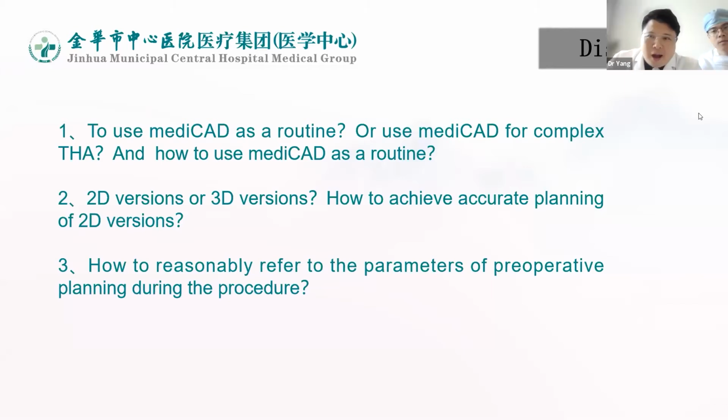So I can't agree more. In China, we must now do the templating with mediCAD, and I think more than in Germany, because in our country the insurance company pays the money for the prosthesis.